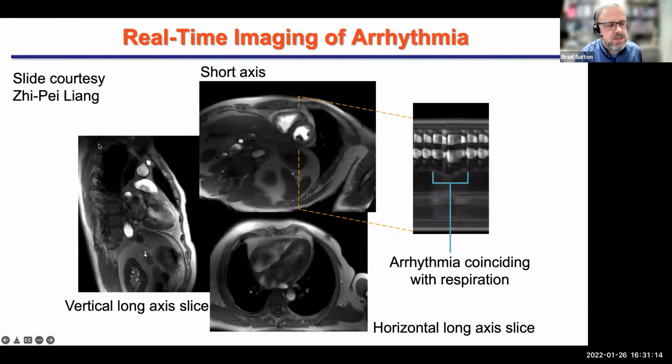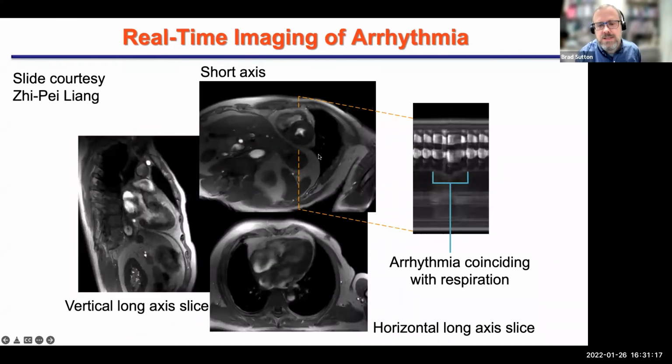And Jipei, I'm going to show 2 slides from Jipei here. He's been able to use this to do a number of amazing things. So cardiac imaging, looking at the blood flow and dynamic heart. And this one even has an arrhythmia. It's not a regular heartbeat. And so we're not relying on things being completely reproducible and repeatable and periodic. None of that stuff comes into play. We're able to get a really good representation of the 4-dimensional data.